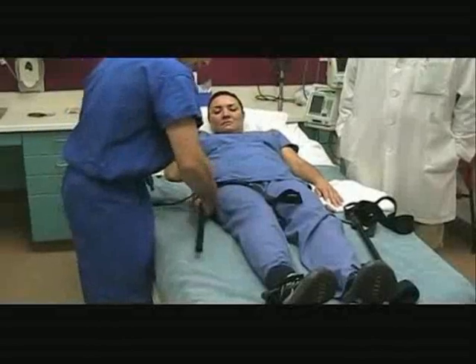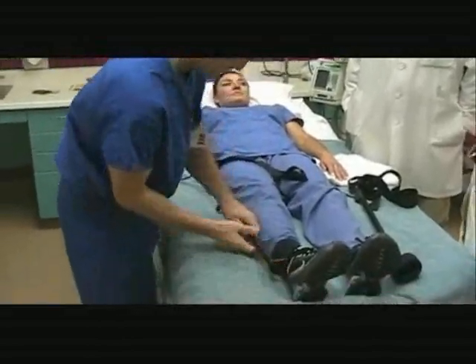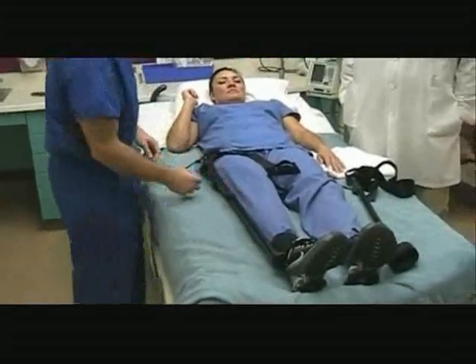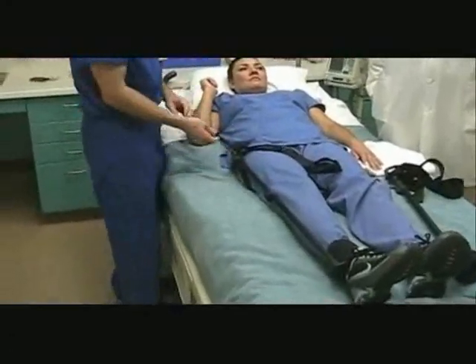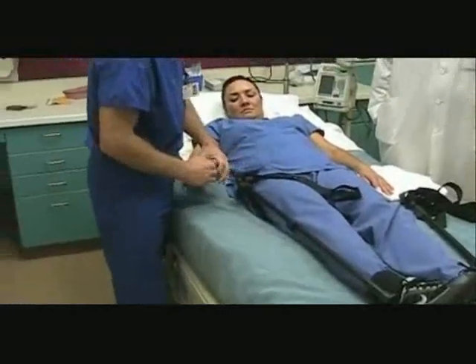This is the coarse adjustment here — lengthen it to as much as you need, stretch it out as far as you can, then lock it in place. And then this is the fine adjustment here. Basically what I often say to patients is, let's pull this cord together until we feel maximum pain relief.